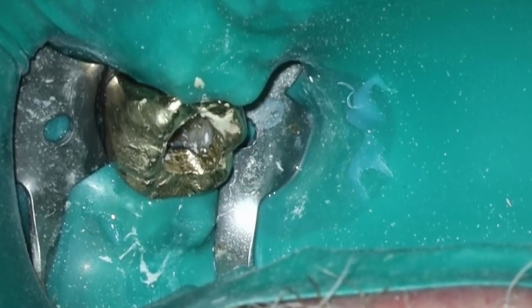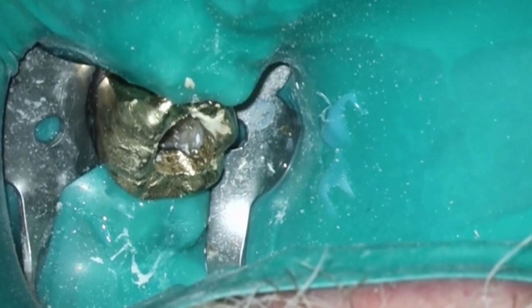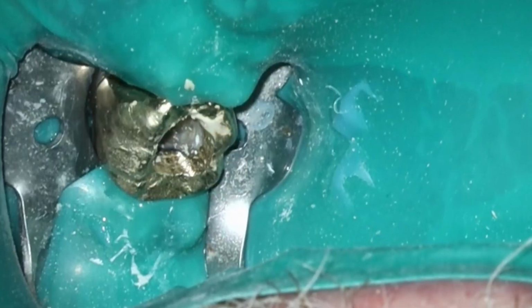But I want to make sure that we truly are patent because, as a reminder, if you're doing the squirt technique, if you are not patent, you're going to have issues with, I think one of the terms for that is vapor lock, where it comes in. If you don't have a clear line straight to the apex, you're going to be short. So it's very, very important if you're going to be doing the squirt technique that you are patent.